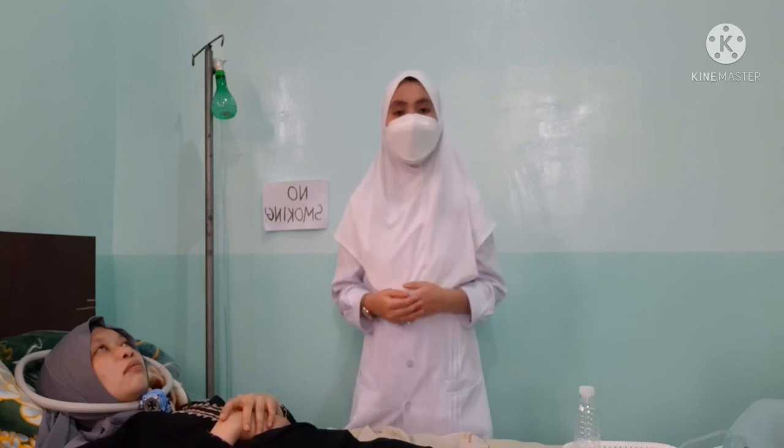Clean the collar with soap and water every day or more frequently to remove secretions if necessary. Clean the tracheostomy collar as needed to remove the secretions. Now instruct the patient or the caregiver on suctioning. Use the frontal suctioning port of the tracheostomy collar. The patient or the caregiver can use the teach back method to demonstrate understanding of instructions.